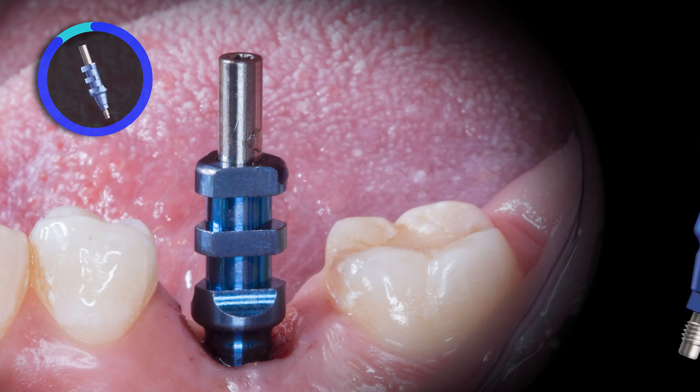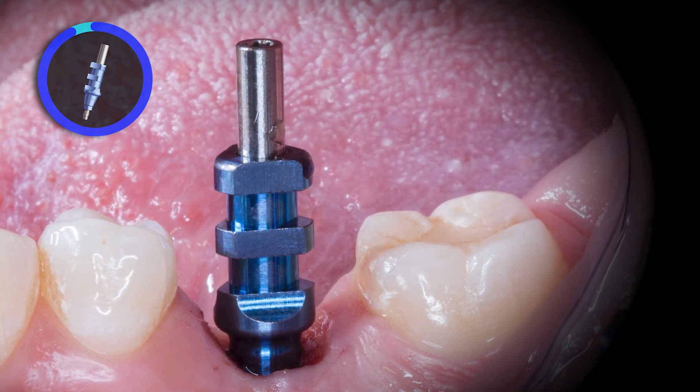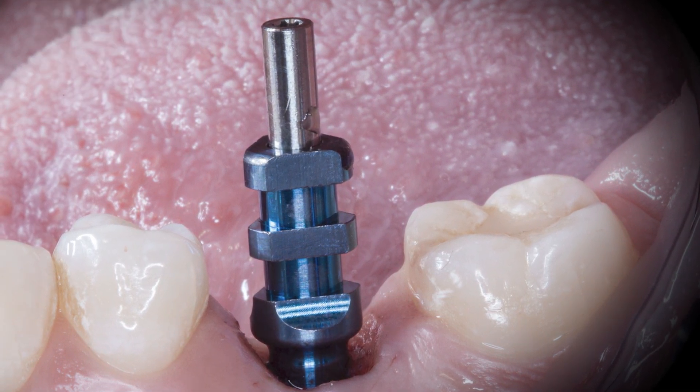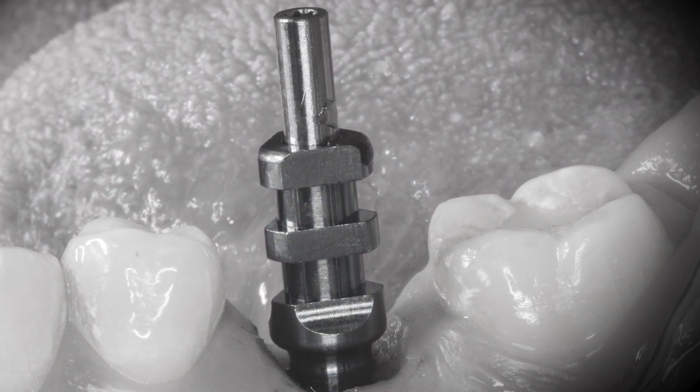Once the open tray impression coping is seated, the adjacent contacts are evaluated and adjusted if needed. Same as before, you can visualize nice broad contacts and a great path of insertion without the need for adjustment.